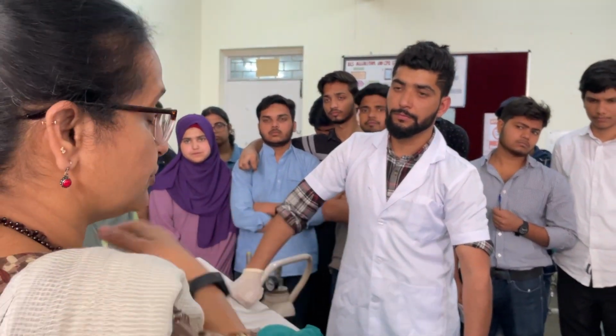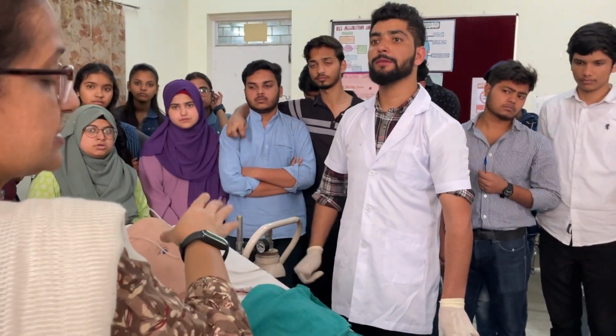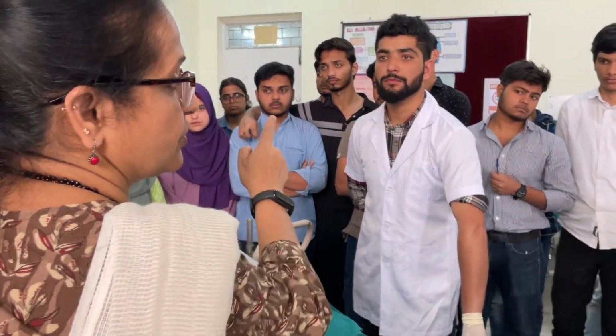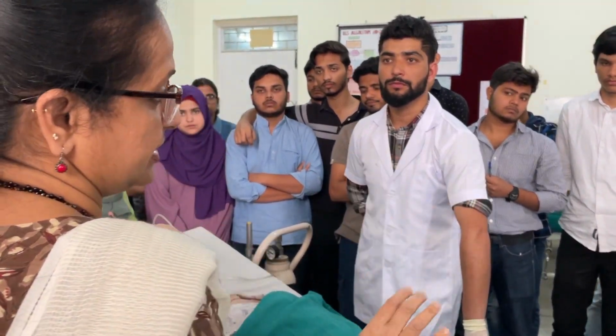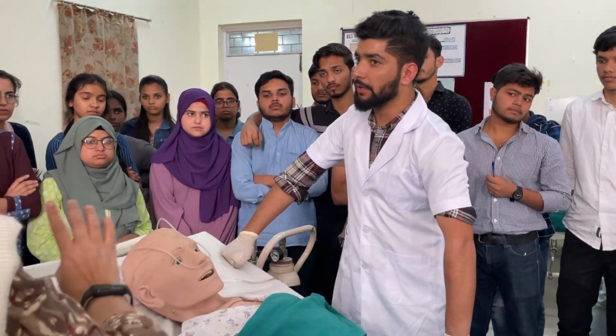And as new students, you should always ask the staff over there, under whom the patient is, how much liter of oxygen is going on, or how much has to be given to the patient. Clear? If it is not mentioned in the record. Okay. And then after cleaning that, and all this you have to do.